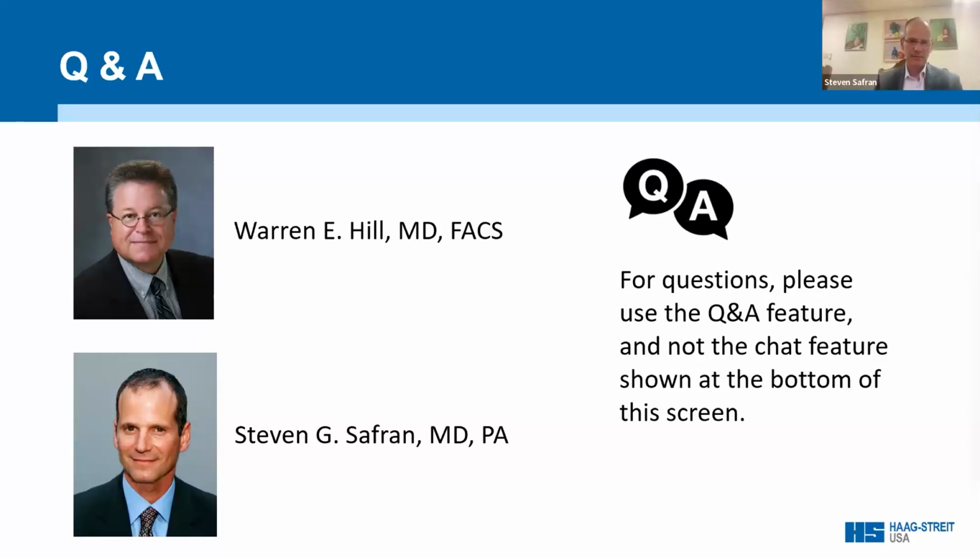Anything additional, Steve? Yeah, I mean, I like to also make sure all the data line up. We have our topography, we have the auto-refraction, we have the Ks from the auto-refractor, we have the Lenstar measurements, and they're all sitting there. And I want to make sure that the data line up, the topography is regular, there's nothing funny going on. And then I look at this and I can start examining the patient, and make sure that everything is consistent.